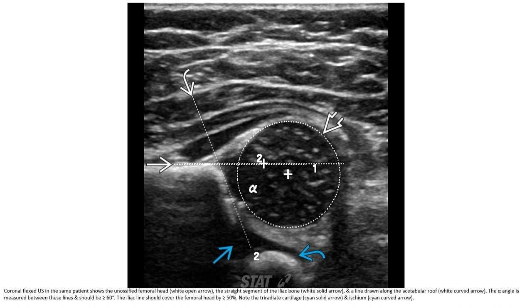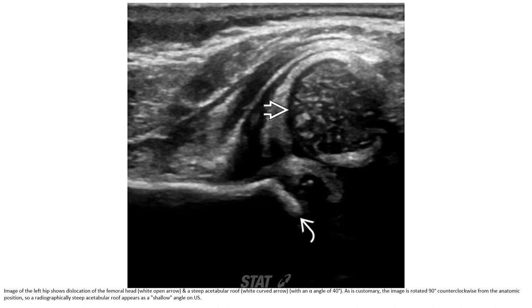Note the triangular cartilage and soft tissue. The image of the left hip shows a dislocated femoral head and a steep, dysplastic acetabular roof where the alpha angle is 40 degrees — indicating dysplasia. The image is rotated 90 degrees counterclockwise from the anatomic position, so a radiographically steep and shallow acetabulum will appear with a shallow alpha angle on ultrasound.